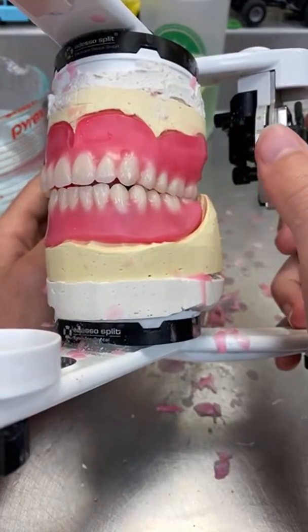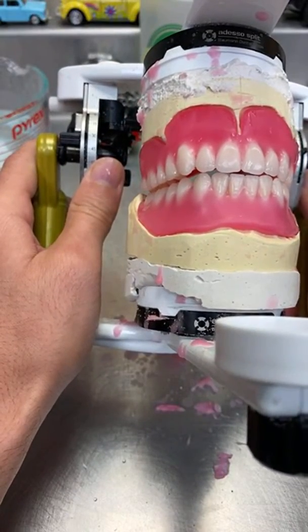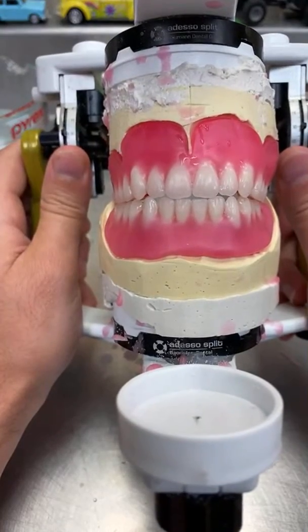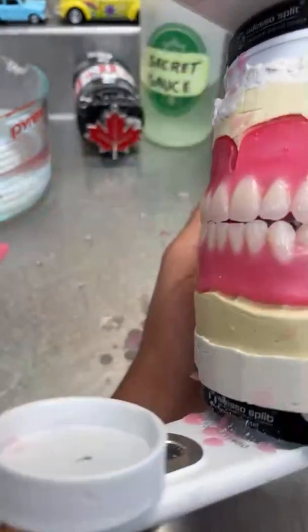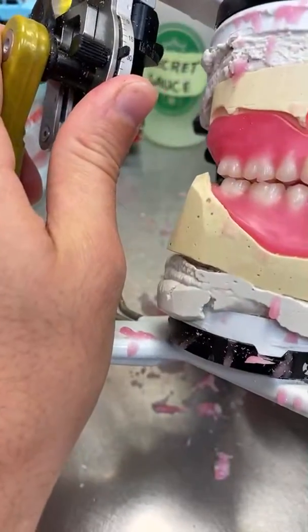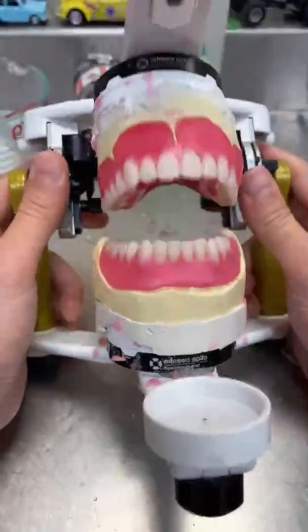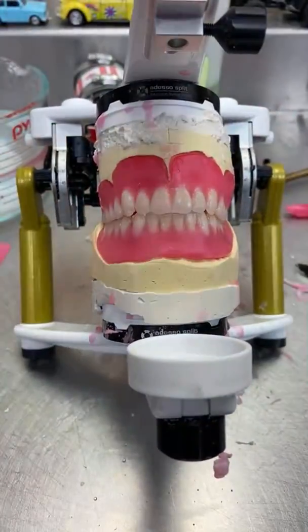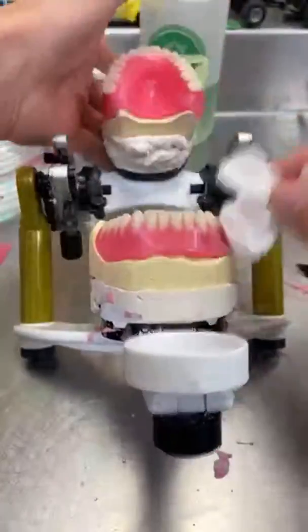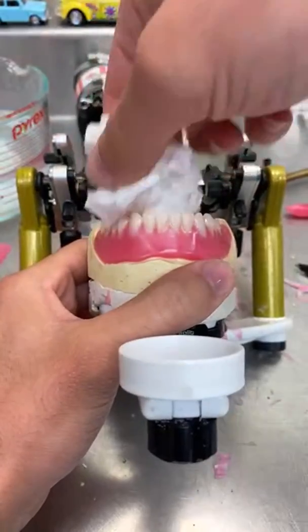You got almost contact and all, and here contact. Now protrusive, which is all the way back, edge to edge, and then you check the posteriors. You have contact except for that premolar, but this is only a try-in, so we don't really care about it. And now only carving is left.